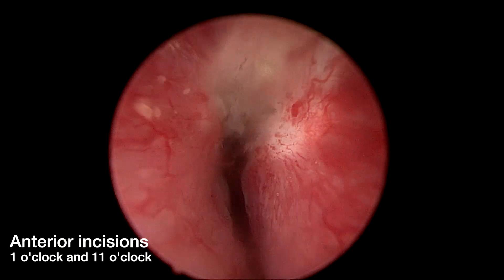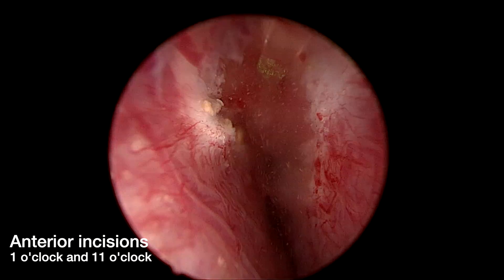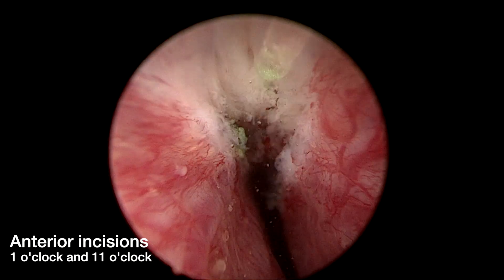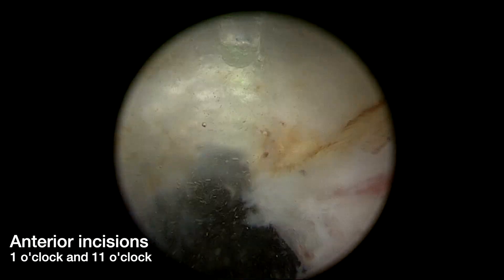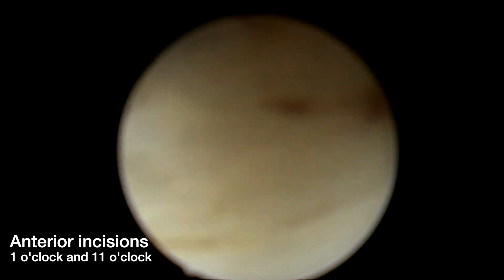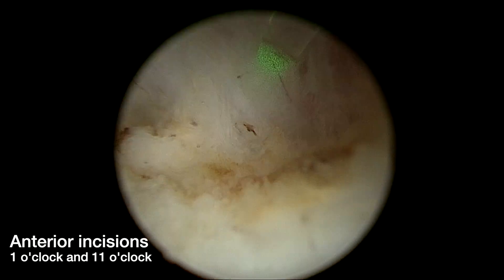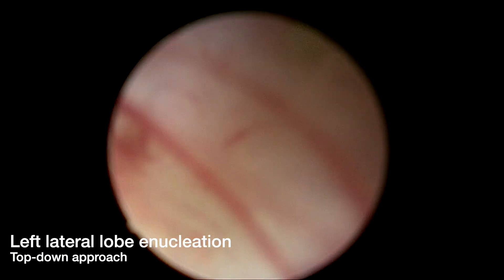We then turn our attention to prostate enucleation. We perform initial anterior incisions made at 1 o'clock and 11 o'clock at the level of the bladder neck, extending distally to the level of the verumontanum. We are careful to ensure the protection of the external urethral sphincter. With the help of some blunt dissection, this incision is carried down to the prostatic capsule.